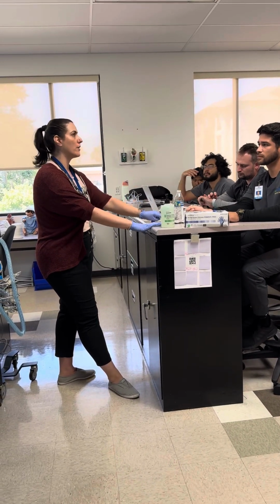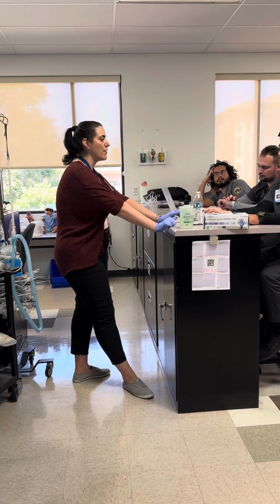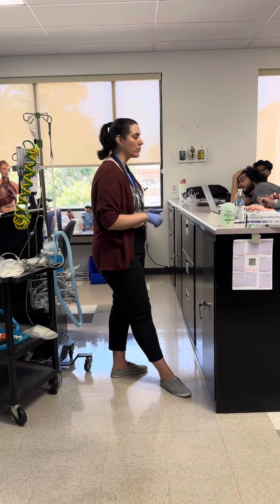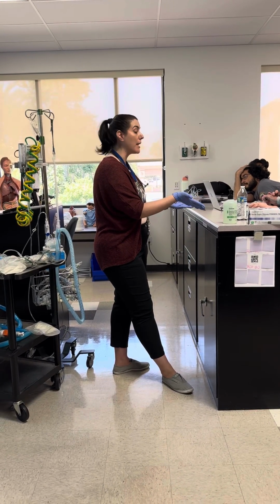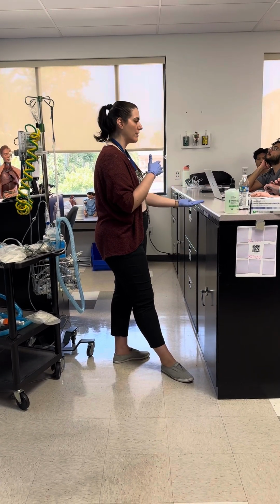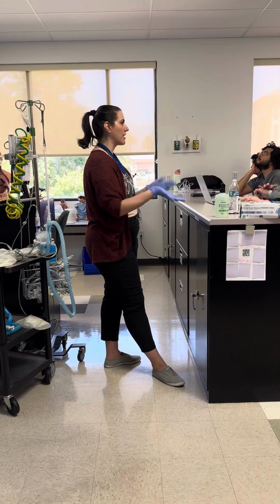Obviously, if you're getting 60 and my pulse oximeter is reading 90, then I'm going to be like, let's try that again. I always have my Apple Watch to correlate because I trust the device pretty easily to match against what you're doing. So it's a matter of me just trying to see that, are you able to do that correlation tactic effectively? So there is going to be a little bit of check off against the machine itself, which I know we're doing with the intent of checking the machine, but this is kind of a way of me seeing, are you checking in the right spot?